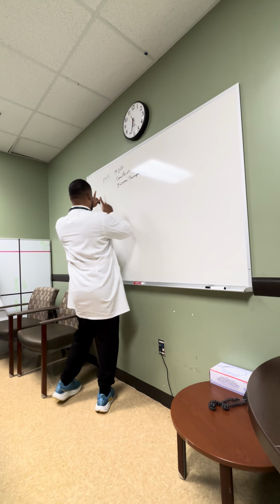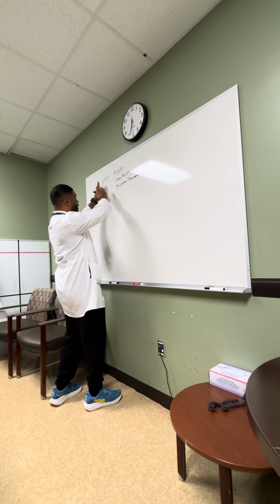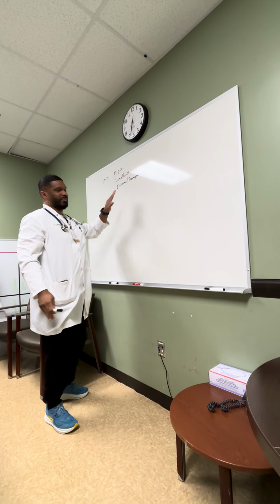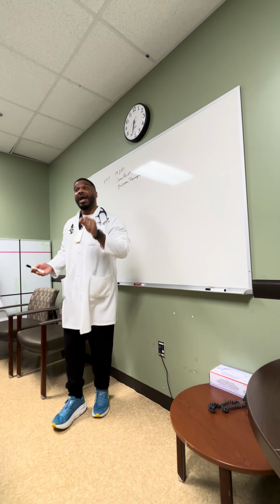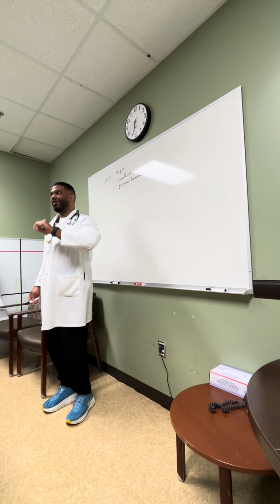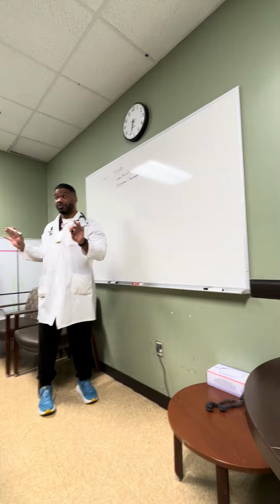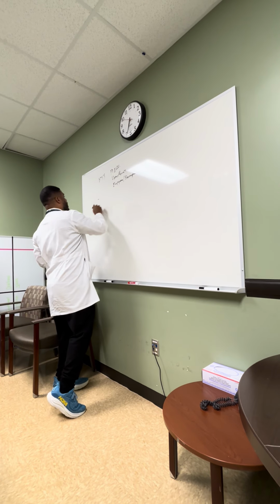So I split these up into two categories. Can anybody think about why I put pneumothorax over here, and pleural effusions, hemothorax, empyemas over here? Right, air versus fluid, and really that dictates where the chest tube is going to go, okay? So I went to medical school, I didn't go to art school, so y'all can't make fun of my drawings, okay?